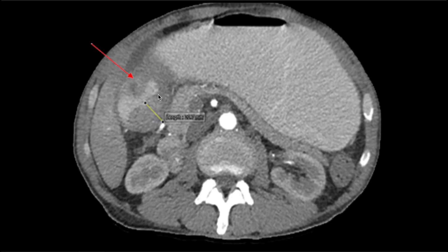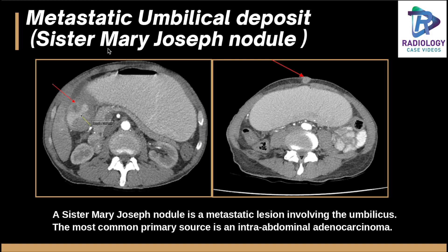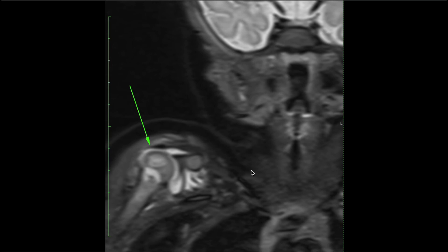Another interesting case: an elderly male presented with gastric outlet obstruction. Wall thickening of approximately 17.7 mm is seen with a grossly distended stomach. There was no significant lymphadenopathy or omental stranding; it appeared to be an operable tumor with no encasement. However, an umbilical nodule was appreciated. This classical umbilical deposit is called Sister Mary Joseph's nodule, named after a nurse at Mayo Clinic who regularly attended gastric carcinoma surgeries and noted umbilical nodules. This represents metastatic umbilical deposit in a case of intra-abdominal adenocarcinoma.